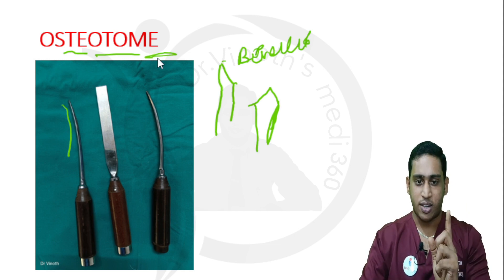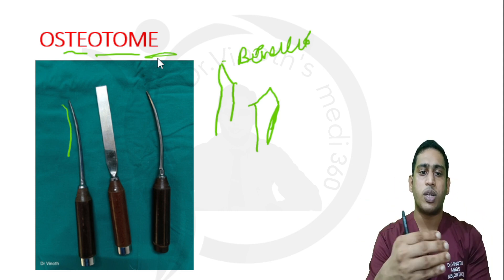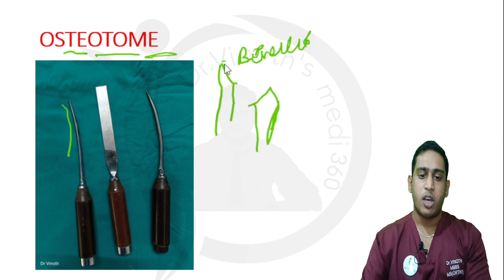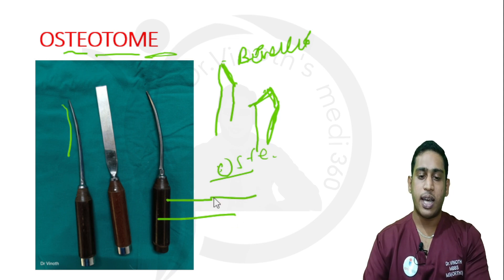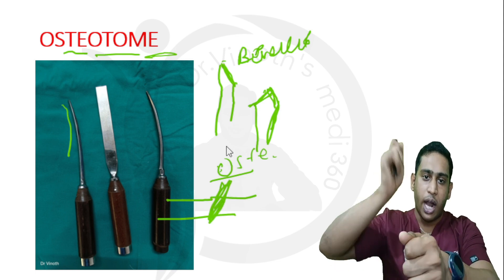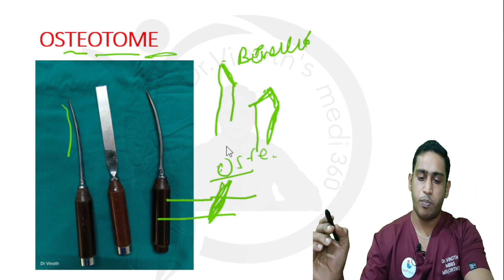Since both the chisel and osteotome look similar and are available in different thicknesses, the difference is specifically at the tip: in the bone chisel only one surface is beveled, while in the osteotome both edges are beveled. The osteotome is used for cutting through bone — not chipping. For example, if there is a deformity or malunion, I use the osteotome with hammering to cut and break through the bone. The bone chisel, on the other hand, is used to chip out bone.